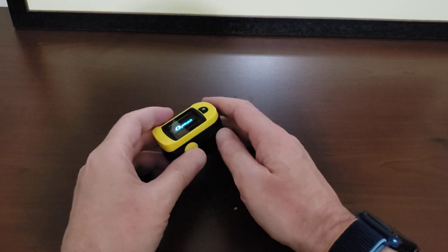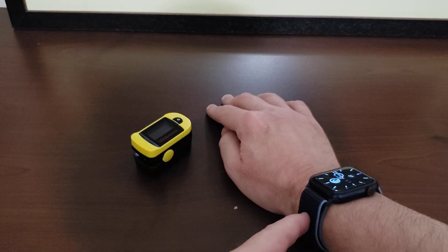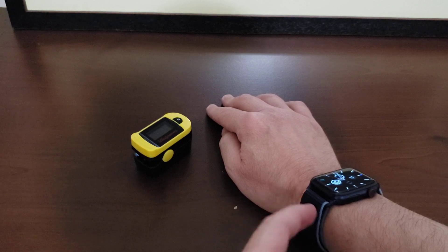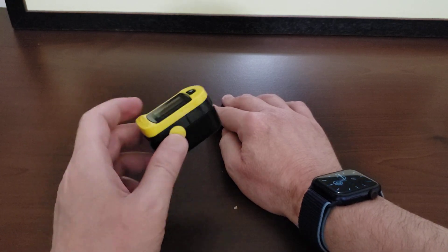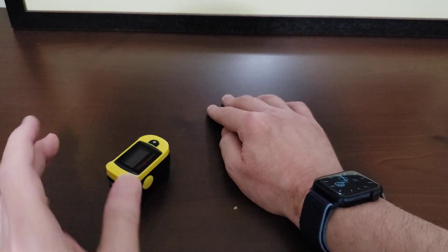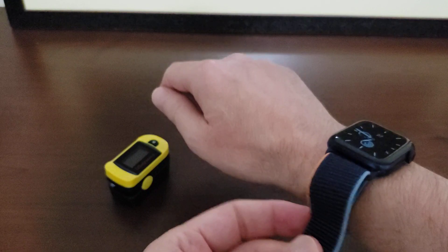Hey, what's up everyone. In this video I want to compare the pulse oxygen capabilities of the Apple Watch Series 6 to a fingertip pulse oximeter from Walgreens.